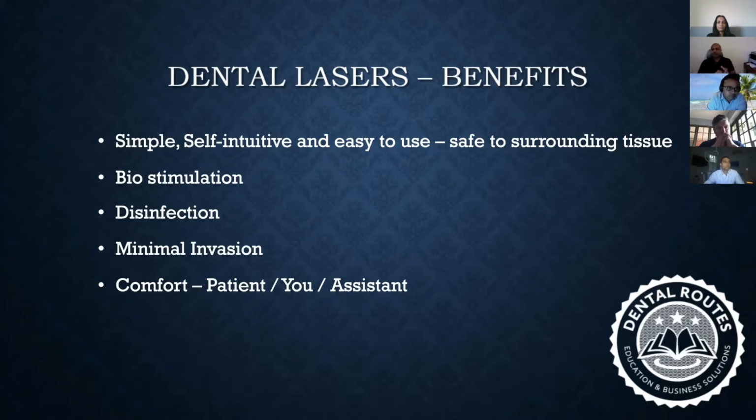It is also very effectively used to completely disinfect and decontaminate areas. This should be the reason why we should bring dental lasers into dental practices, because I think the oral cavity is one of the most common areas for infection. This is one space where we leave everything open, and we are giving chance after chance for sites to get infected. If you have a way to disinfect your sites of application, then what better way?